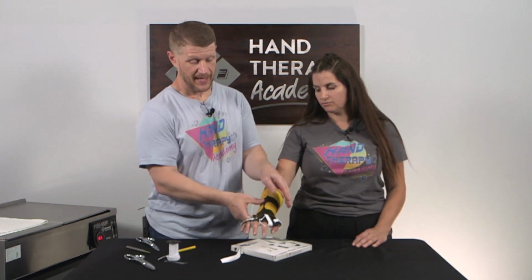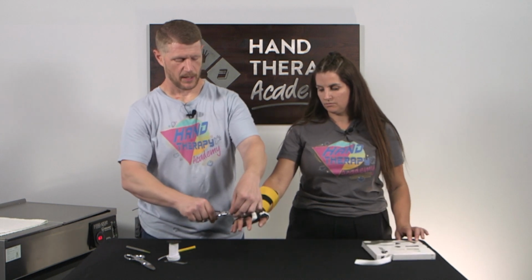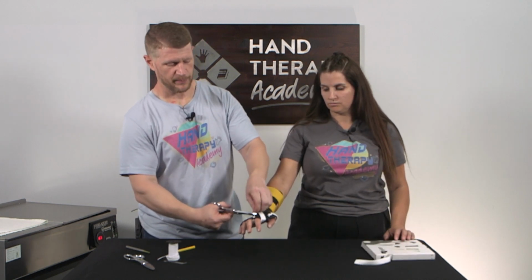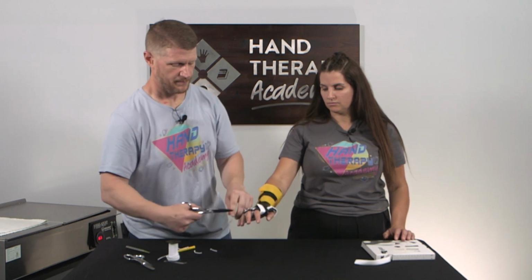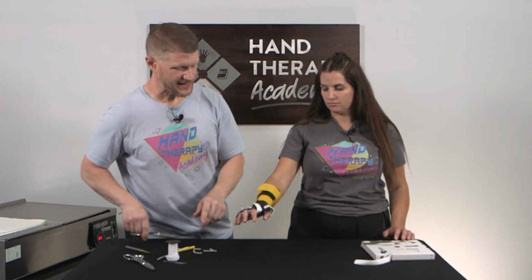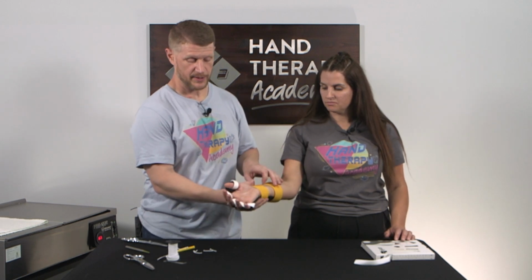But this gives them a low profile, again, we trim all these guys down, a low profile version of a radial palsy splint that doesn't have a giant coat hanger hanging off of them. So it takes a little bit of extra time to make compared to some of our other quick stretch and tag splints, but there you go.